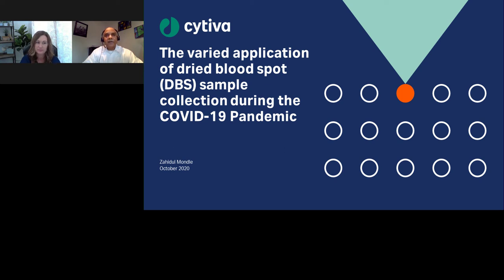World Health Organization is trying to understand COVID-19 pandemic surveillance. World Health Organization has approved the DBS system for HIV surveillance and is now stepping up with DBS samples to understand SARS coronavirus 2 as well. And also, scientists have developed a convenient low-cost antibody test for COVID-19 based on the dried blood spot sampling technique. It's also in an automated ELISA format.